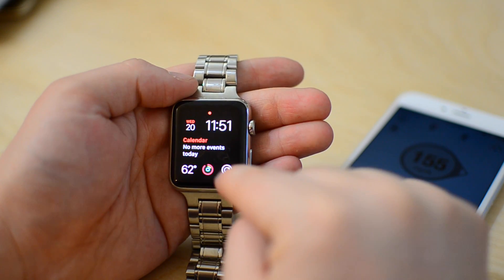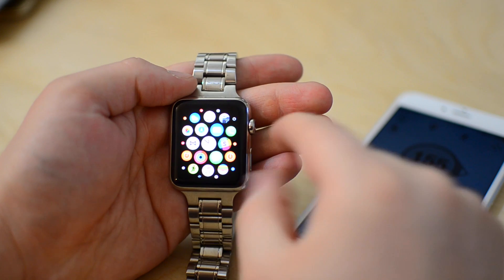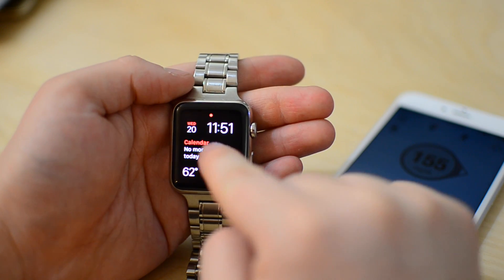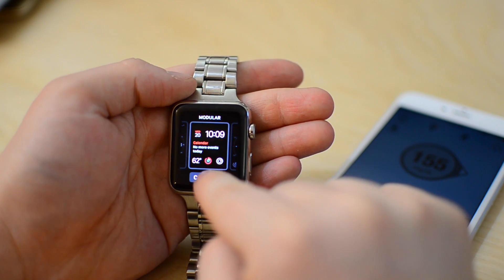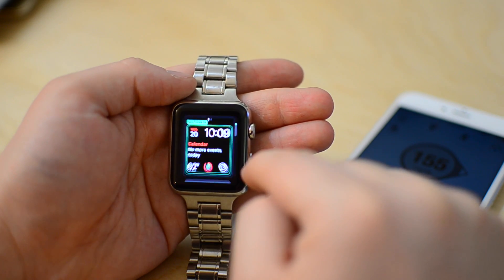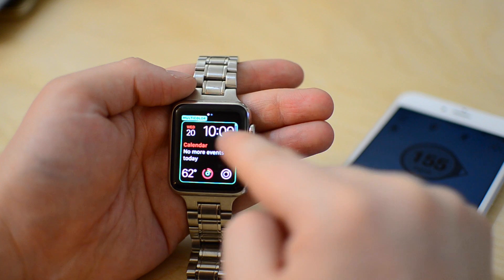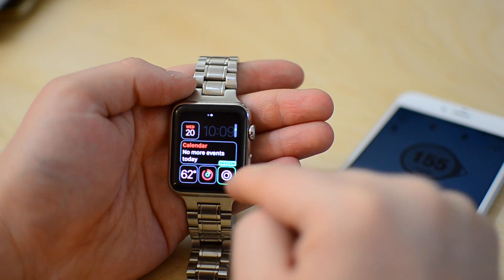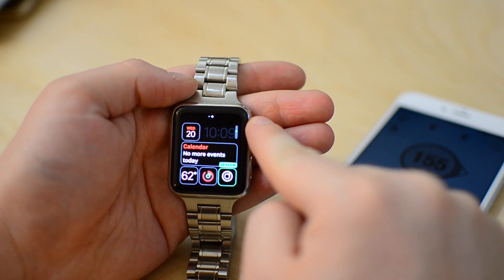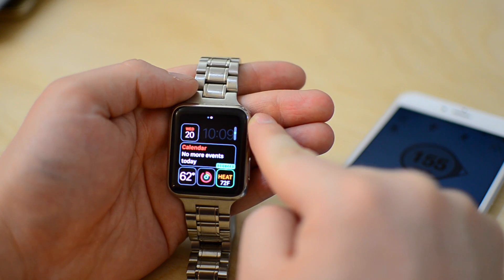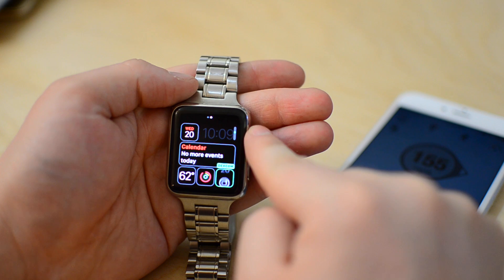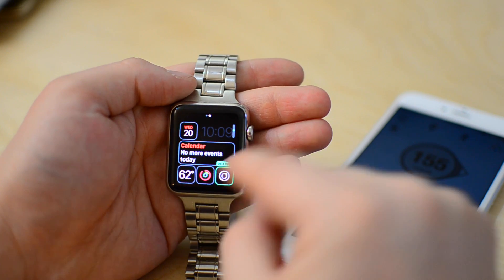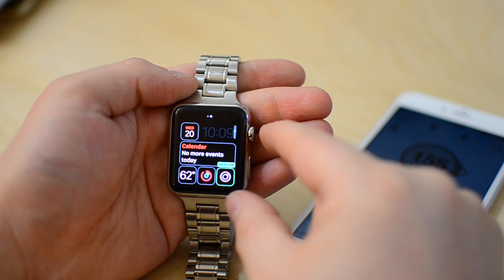To add a custom complication like that is pretty easy. You just need to force touch — press really hard — on your Apple Watch screen and hit Customize. I'll choose that little corner down there. You can see you can change this to any other apps that have custom complications, but we will choose the Dexcom one.